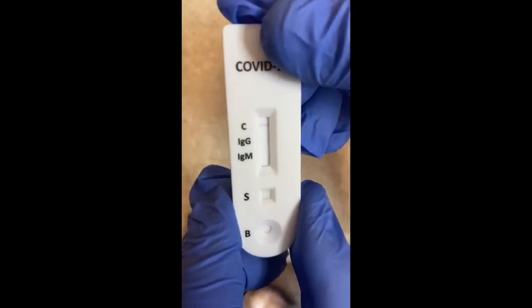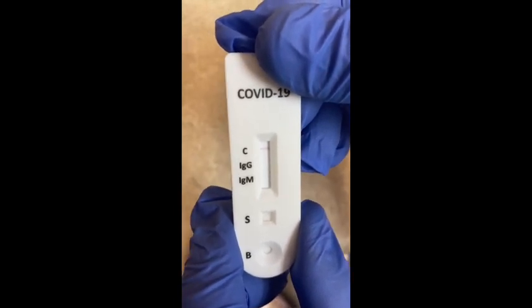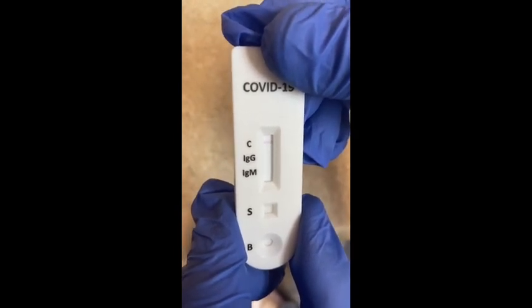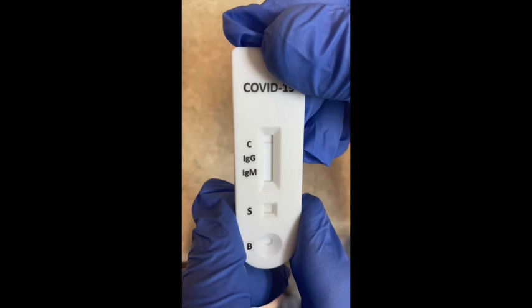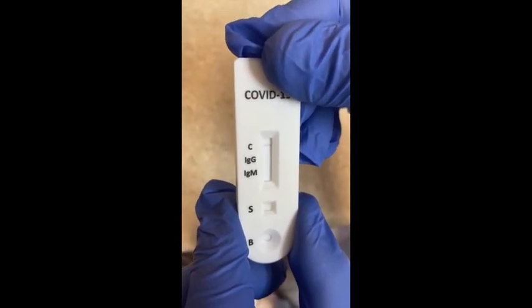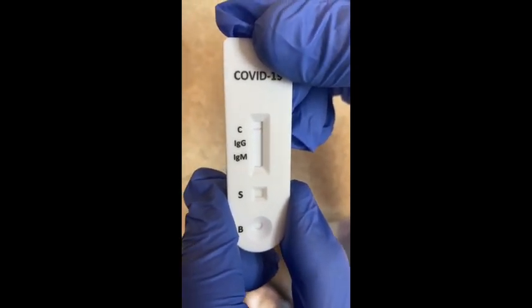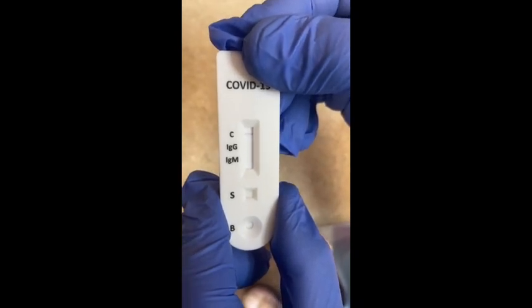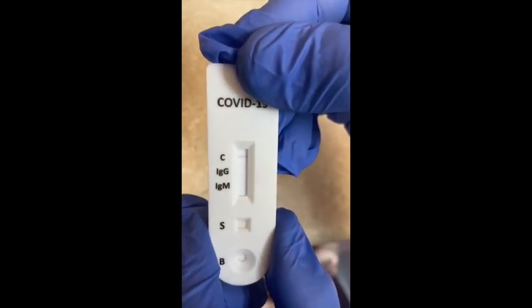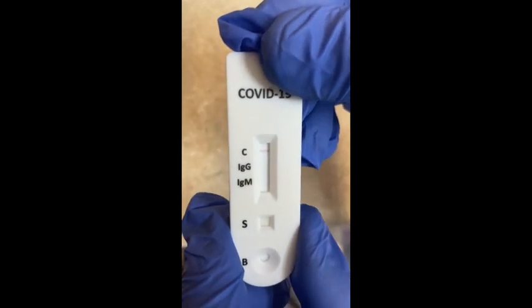When you read the result where it says C, that's your control — you must have a line there at the C. If you have a positive, you have IgG and IgM, and you can have either or both of those red lines, and that is a positive. One of them indicates a current infection, and the other indicates antibodies from a past infection. Your provider will be the one to determine that.